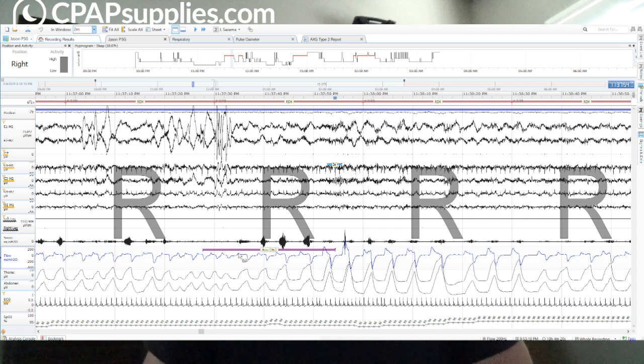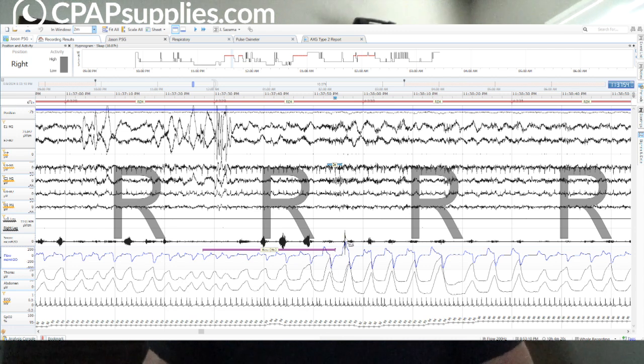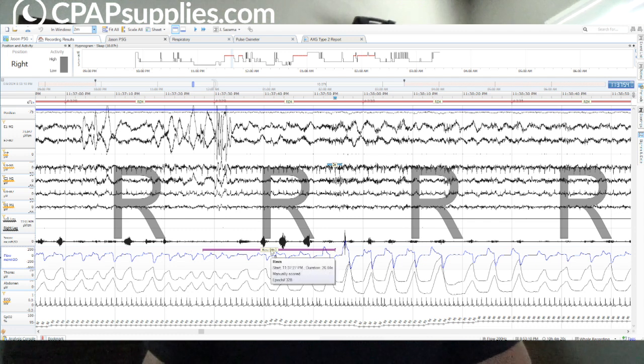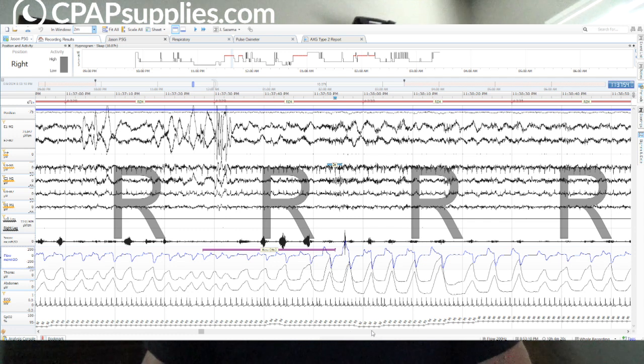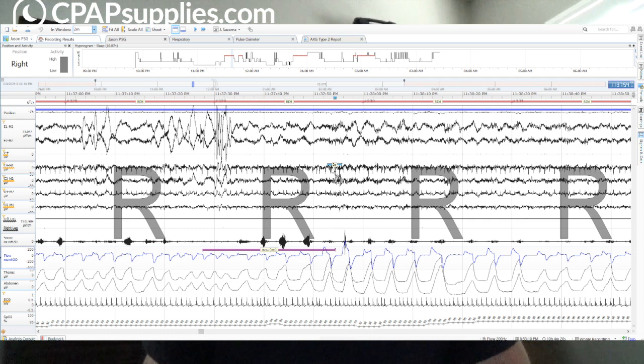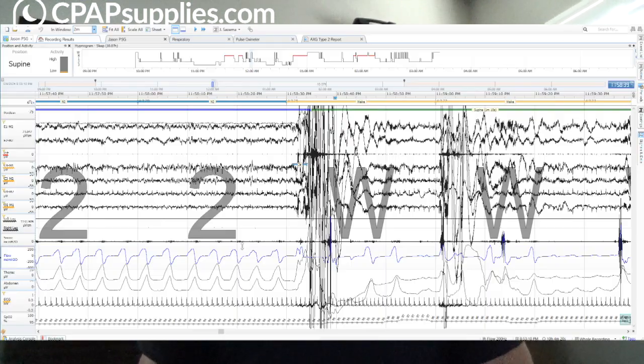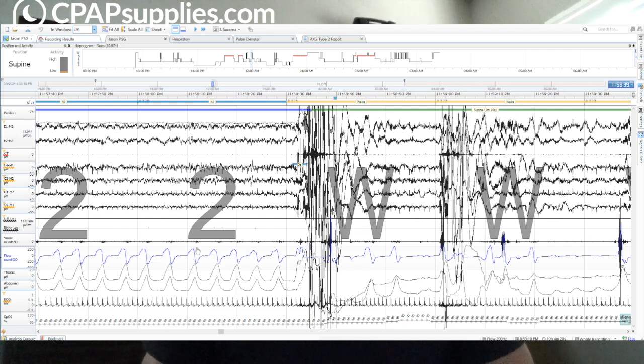So here's another RERA. So it comes up to a sharp point. We see a clear decrease in breathing. As far as breathing effort, the amplitude of it. But we only see an oxygen desaturation of 4%. It goes from 94 to 92. But we see a definite change. There's a definite shift here in the EEG. So it's definitely an awakening. And we have building snores leading up to it. Okay, now I want to show you something really cool. So this dude's been on his right side forever. There's no reason for this awakening. All the tops of these waves look really pretty good. And then we have an awakening. So nothing happened.